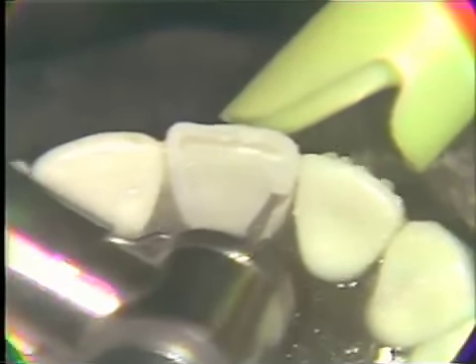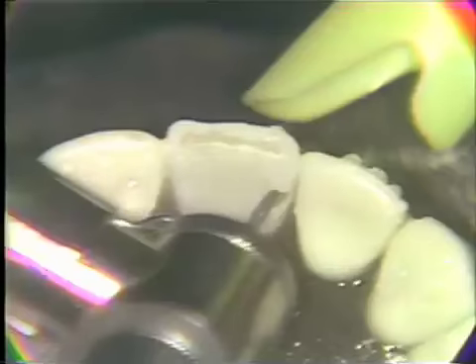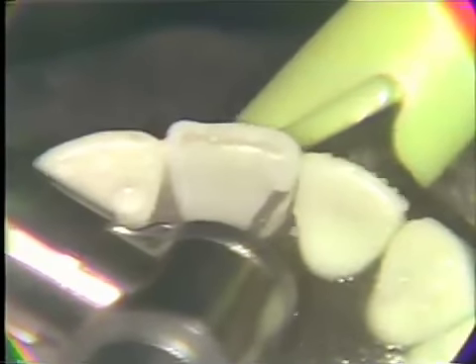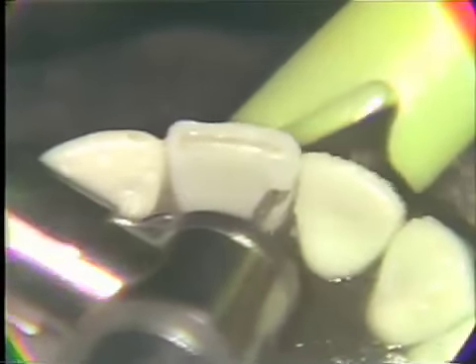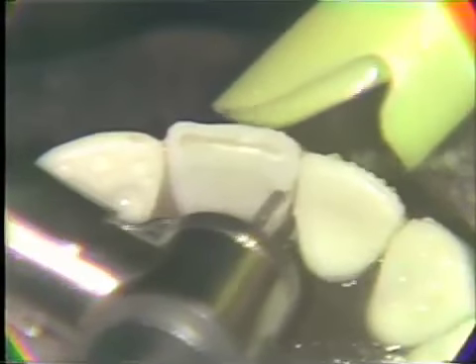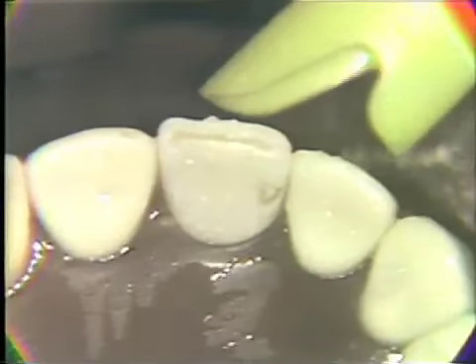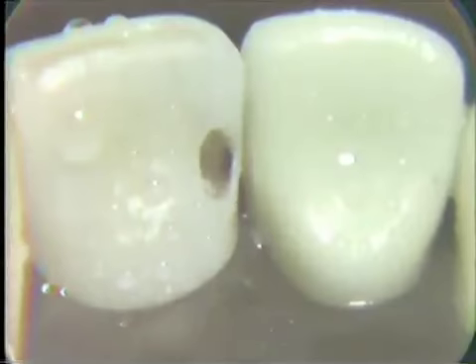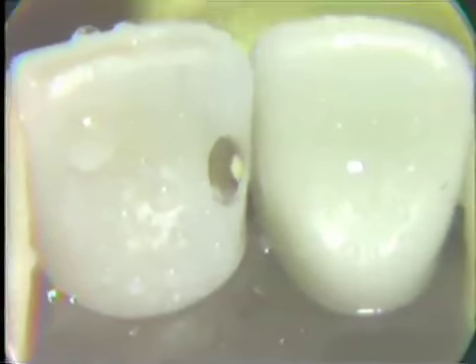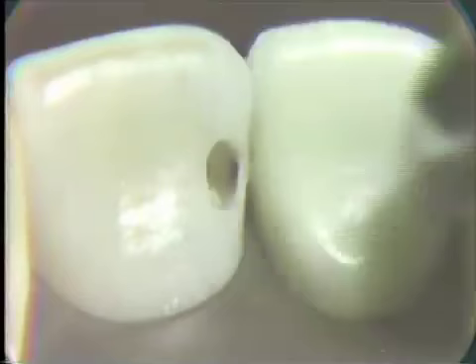There's going to be a greater depth to the axial wall as we move incisally because of the greater thickness of the enamel. We want to thin down that enamel, but still maintain the protection of that for the adjacent tooth. Now we'll dry that area and get a better look at it from the lingual.